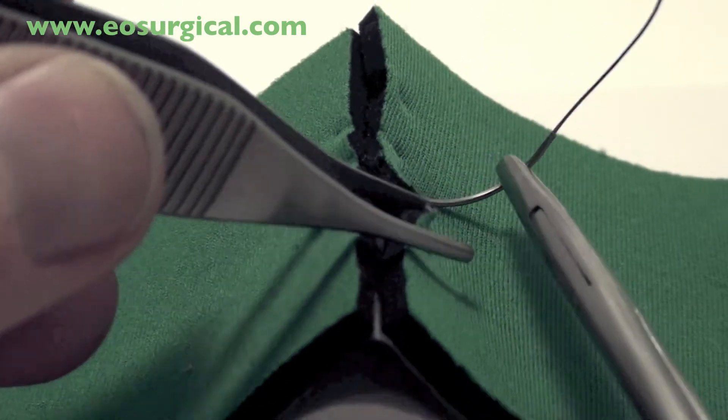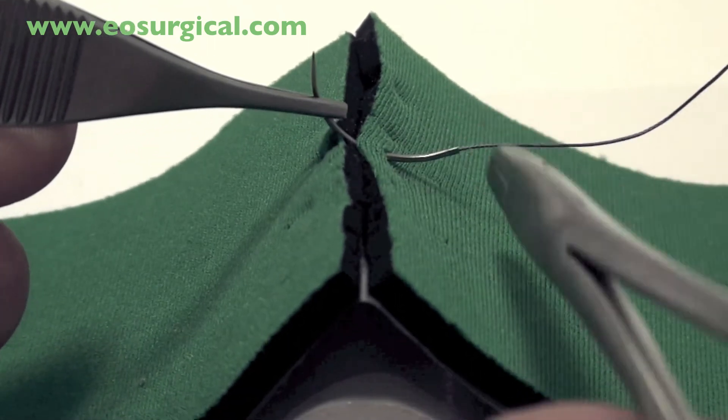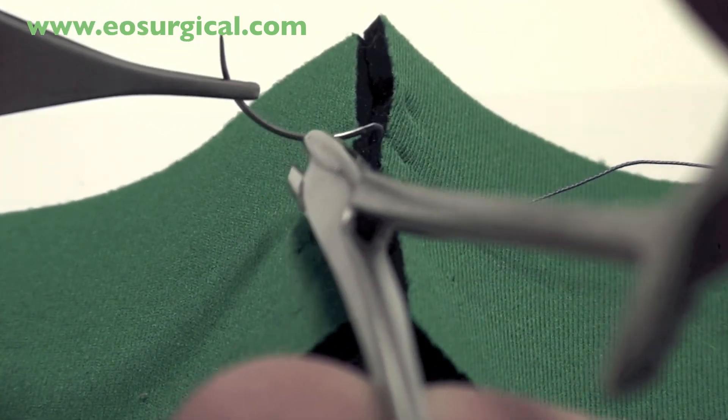When you're passing through the tissues, make sure that you rotate your wrist so that the needle follows its natural curvature and causes minimal tissue damage, as shown here.